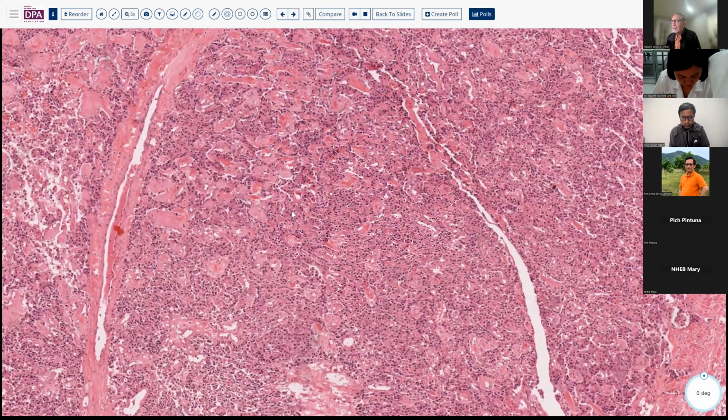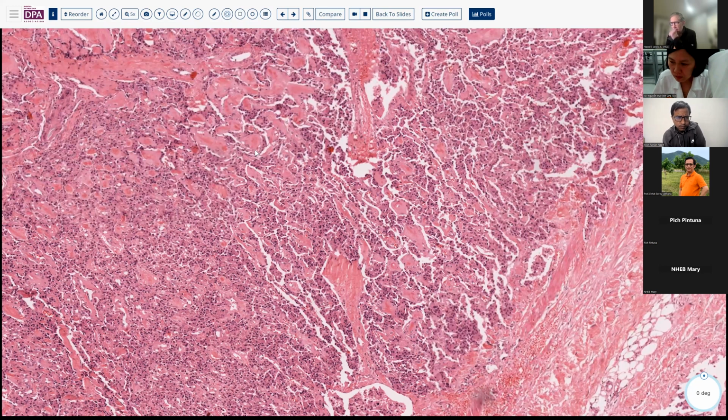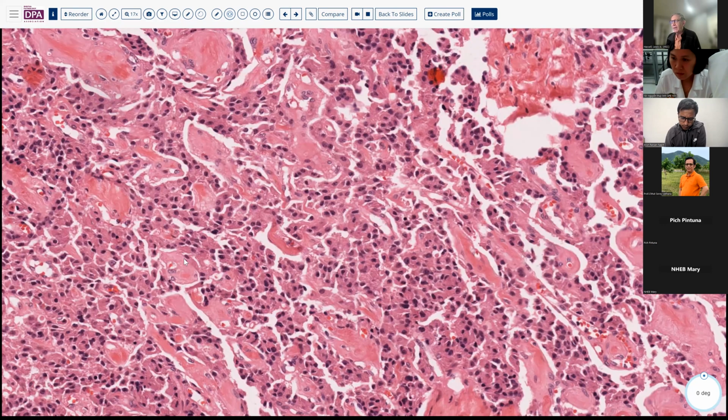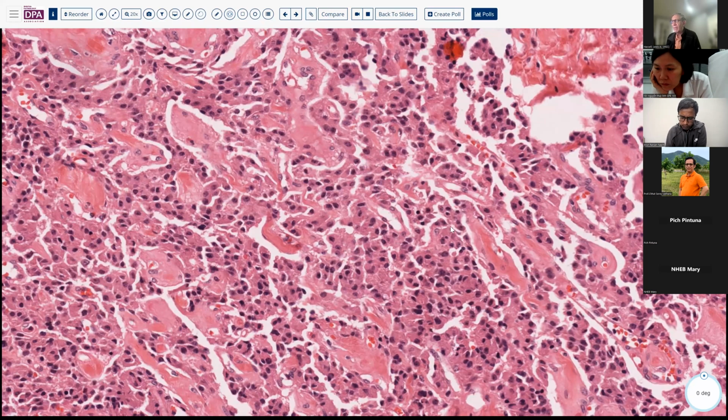So this is a more diffuse pattern, almost a little bit of amyloid in here, which could suggest that this is an insulinoma. And so seeing the presence of amyloid-like hyaline fibrous tissue here is a marker that's more frequently encountered in insulin-secreting tumors, but it's not an absolute criterion. It's just a looser association. But here you see very eosinophilic cells, fairly bland nuclei, and you'd have to hunt for a little while in this to find mitotic figures.